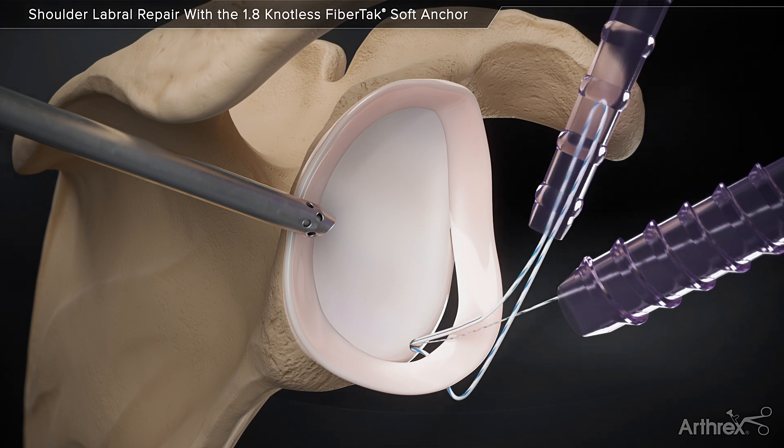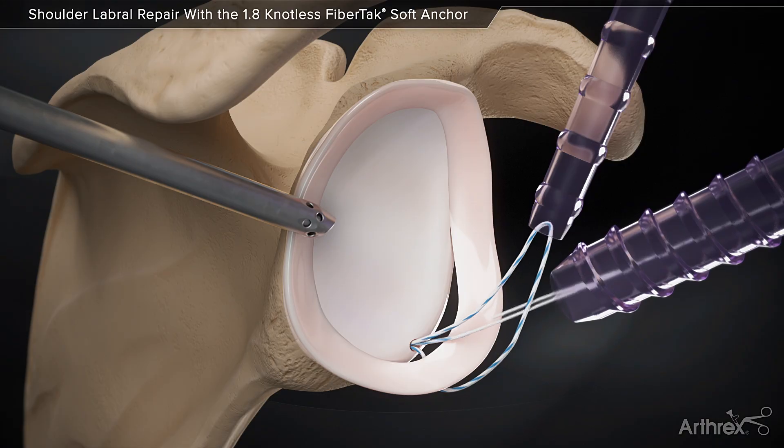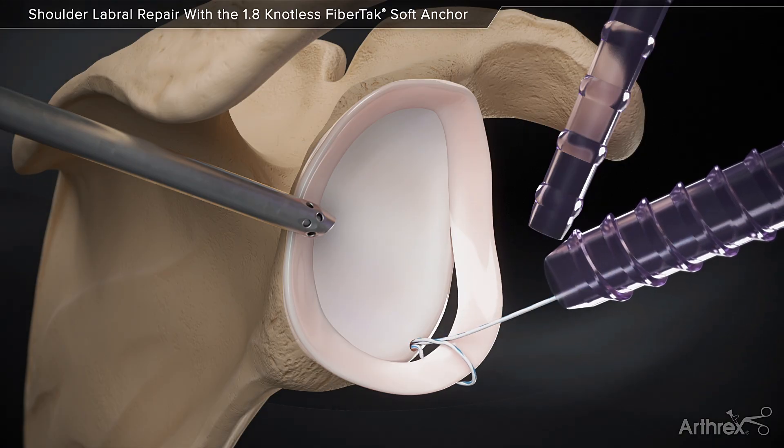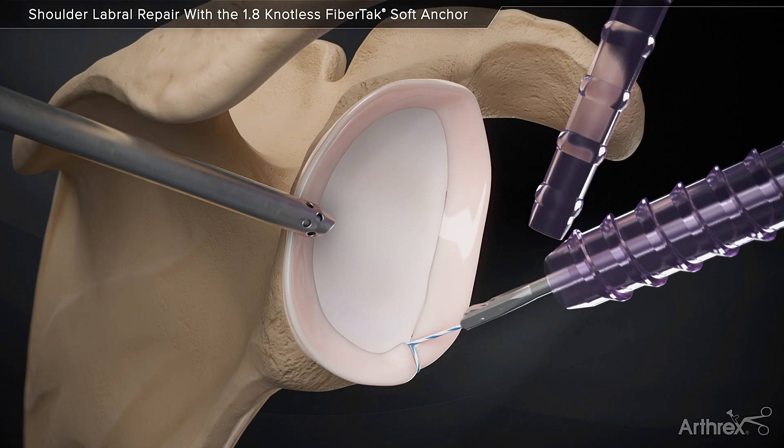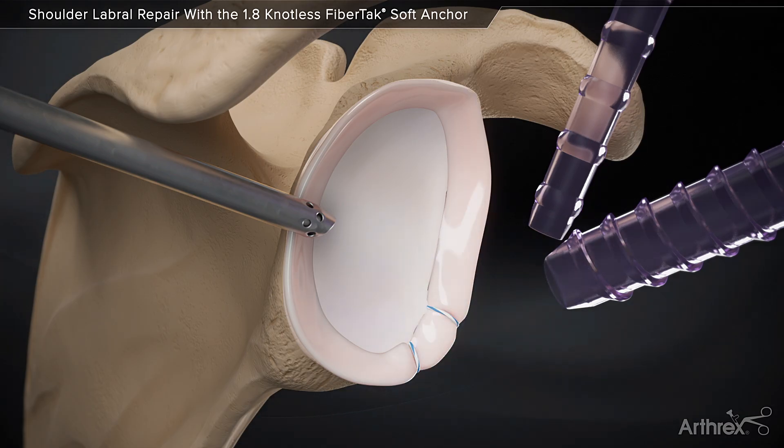Pull the tape end of the shuttling suture to shuttle the repair suture. Use repeated light tugs to pass the repair suture through the knotless mechanism. Continue to tension the repair suture until the desired repair is achieved. The suture tail is cut flush, creating a secure, low-profile knotless repair.